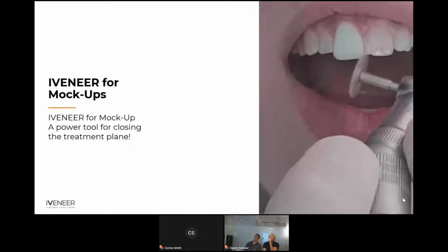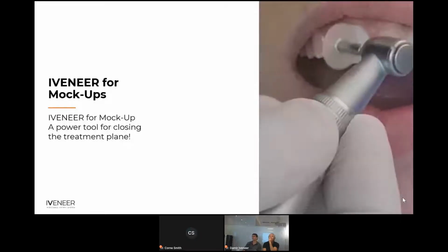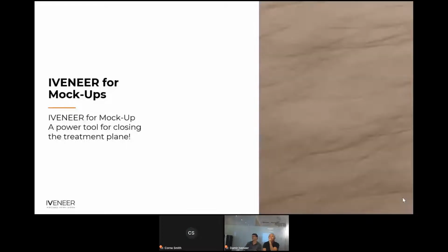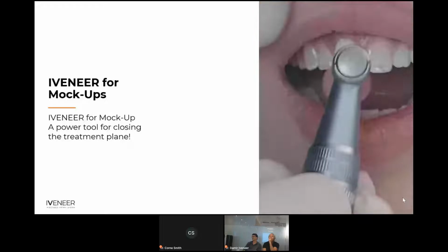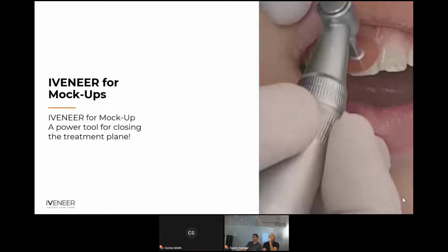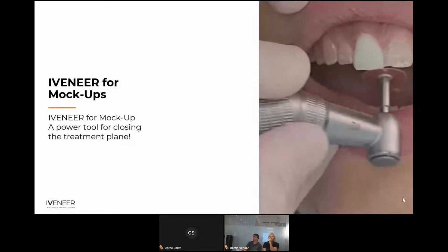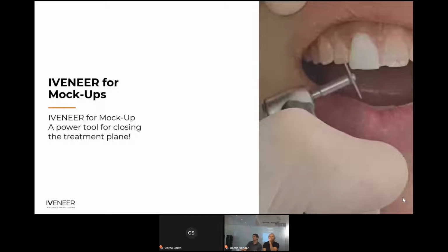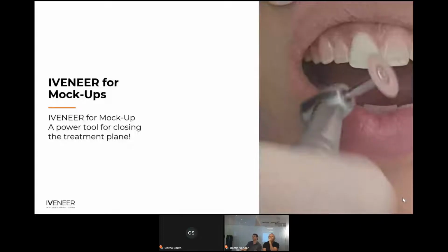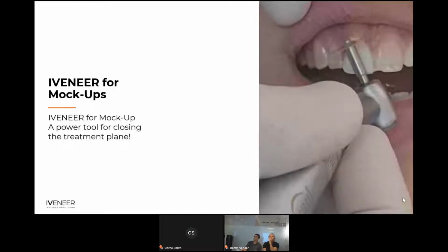And then I do a little bit finish and polish. You can see that the cervical area is perfect. And after I finish to do a little bit finish and polish, I can show the patient the result. I specifically choose the very bleach color because I wanted to show the patient the differences. Go a little bit for the gum line.